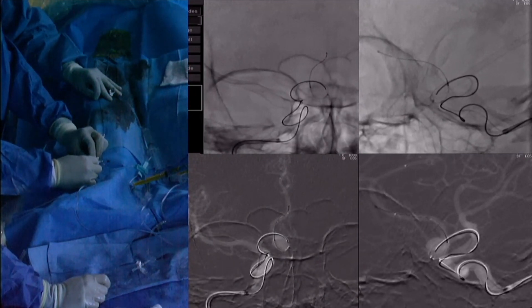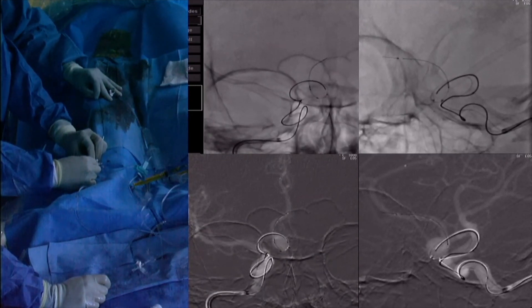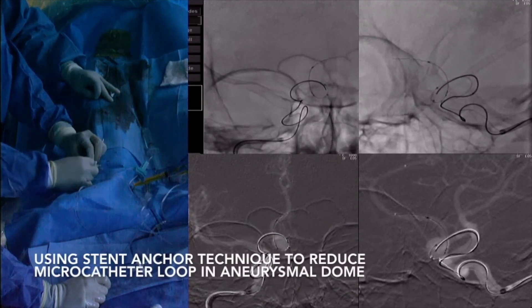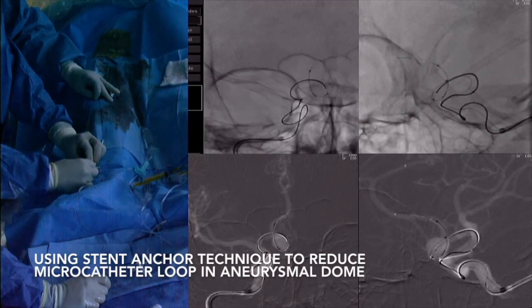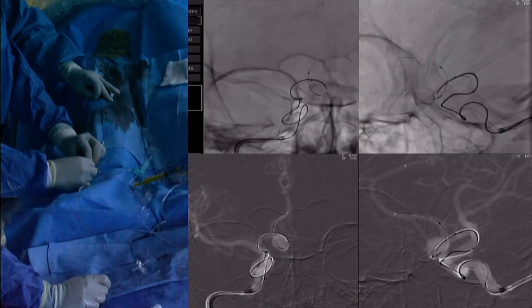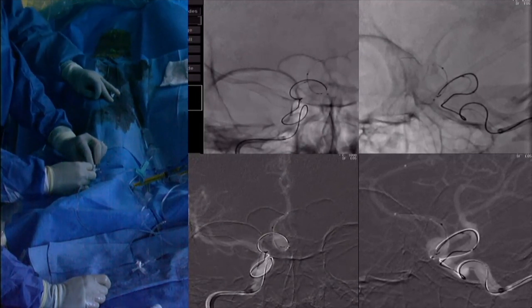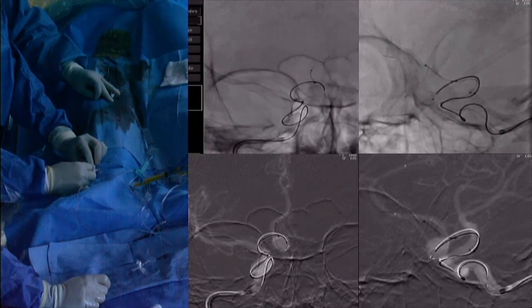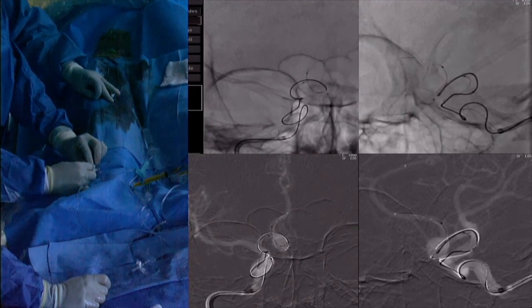Slowly, we bring the microcatheter proximally and begin to unsheathe the stent in the A2 segment of the anterior cerebral artery. As shown here, the stent is being unsheathed and the distal tines are opening. Once the distal tines open and the stent begins to become expressed, using the pressure of the self-expanding stent on the vessel, we begin to reduce the loop of catheter and stent in the aneurysm. Here we see the loop snap back and the loop is effectively reduced.